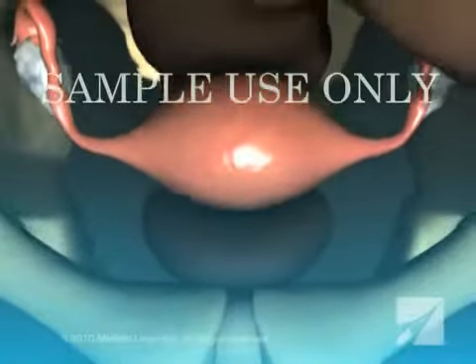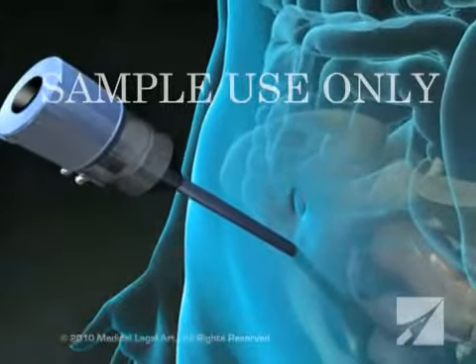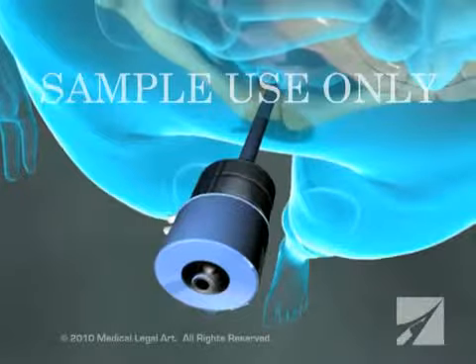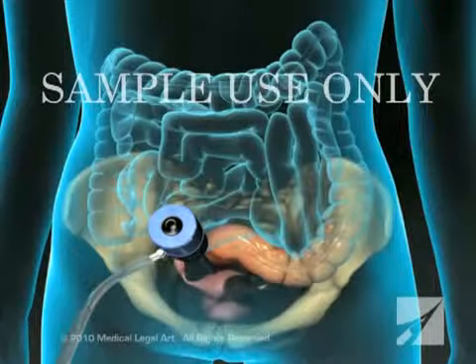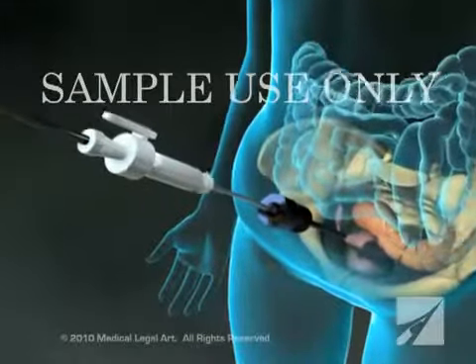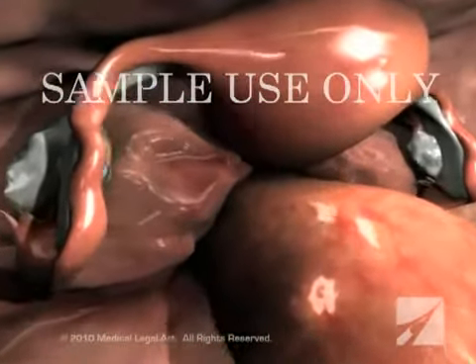Your surgeon will gain access to the interior of your pelvis by using a sharp instrument called a trocar to make a small half-inch opening or port just below your navel or umbilicus. Carbon dioxide gas will then be pumped through this umbilical port to puff up your abdomen so its contents can be viewed more easily. Next, your surgeon will insert the laparoscope through the umbilical port. Images from its camera are projected onto a video monitor in the operating room.